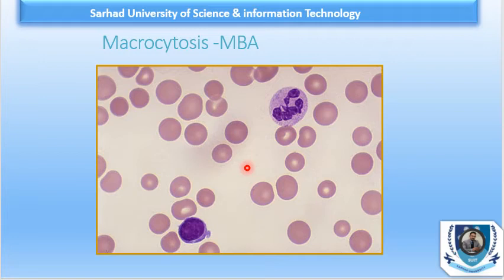So up to here we discussed two different cases. The first one is microcytic anemia. In microcytic anemia, the first thing we look toward is MCV and hemoglobin, and if MCV is lower, then we look toward its peripheral smear. In the peripheral smear we have microcytosis along with hypochromia, and if this is a case of IDA, iron deficiency anemia, then we have some elliptical cells as well. And in macrocytic anemia we have high MCV along with hypersegmented neutrophils.